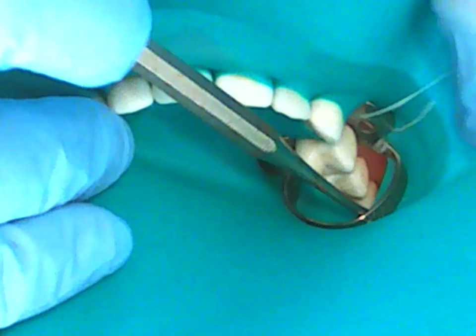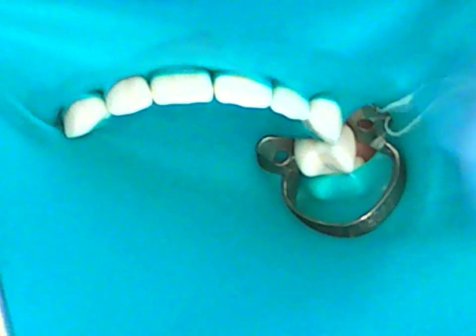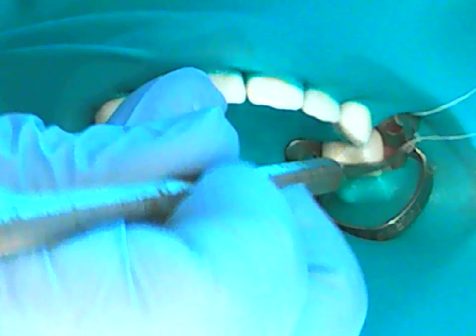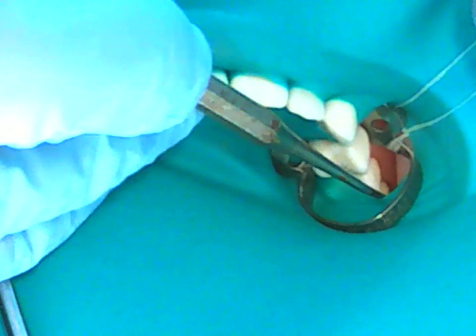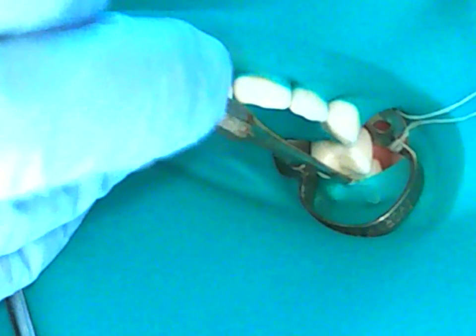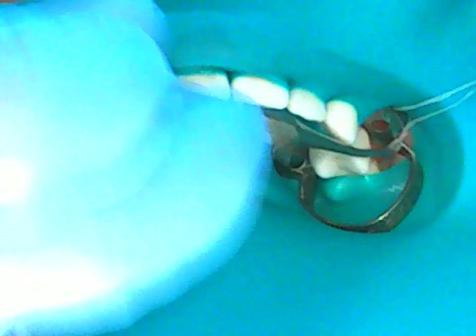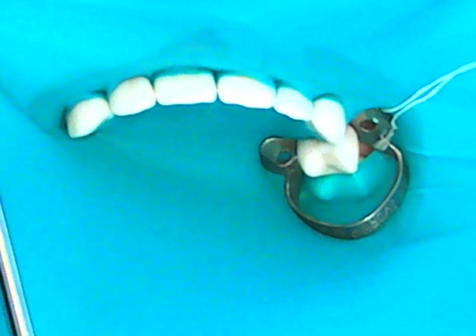Sorry, you can't see that very well. See how I'm just stretching it and pulling it forward a little bit. And it covered it up. And there you go. One more time perhaps. Going in, pulling it up, and I'm pulling it forward with my flat plastic, and I don't want to have this poking through like so. You want to have it the opposite way where you're using basically the handle to lift it. Okay, good. And that's how you get that around the 2-5.